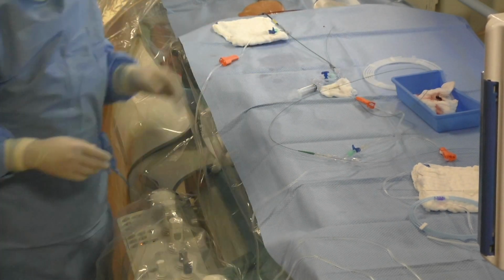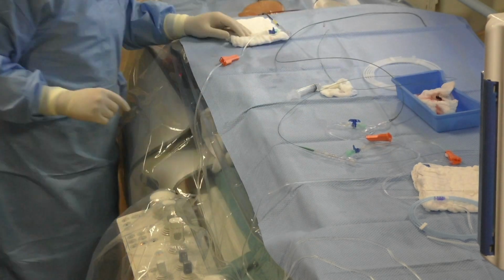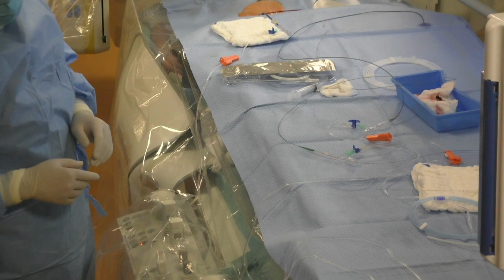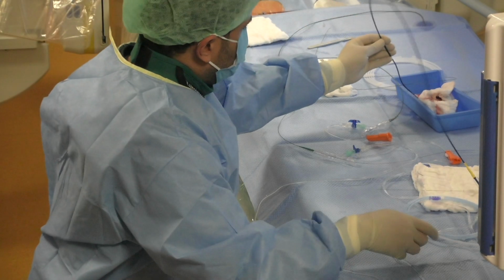And now we've finished our intervention, and we're pulling our catheters out of the patient, closing our puncture with the Angio-Seal.